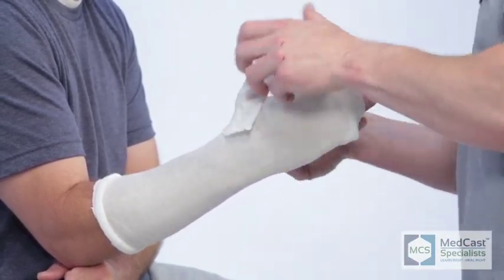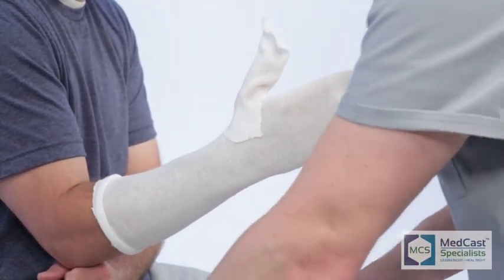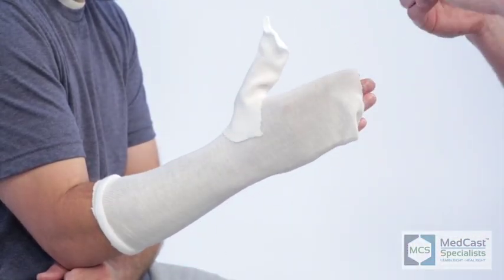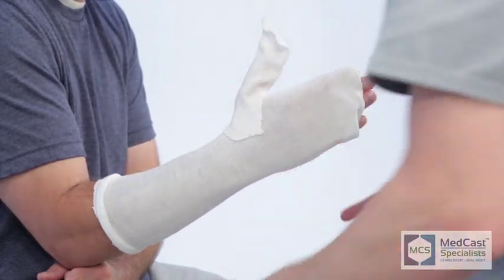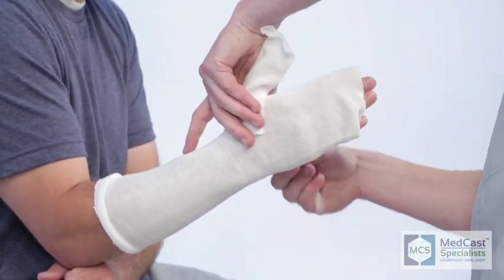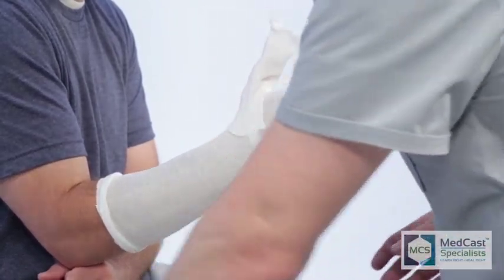We found that casts are a better experience for patients. Anytime a patient transitions from a splint to a cast, they always say the cast was much more comfortable — it's usually a little sleeker and smaller. You're going to have better patient compliance because they cannot take an ulnar gutter cast off, assuming you put it on correctly, whereas they can take a splint off.